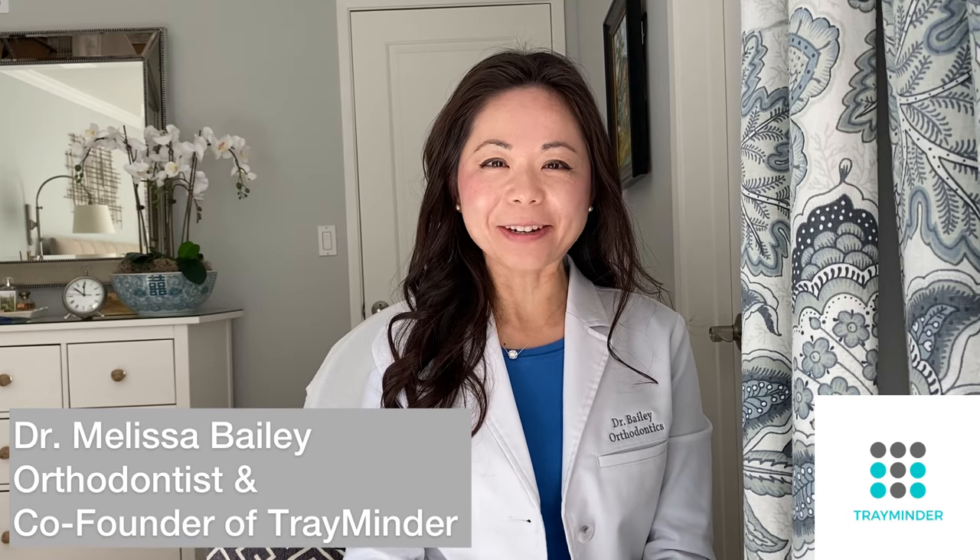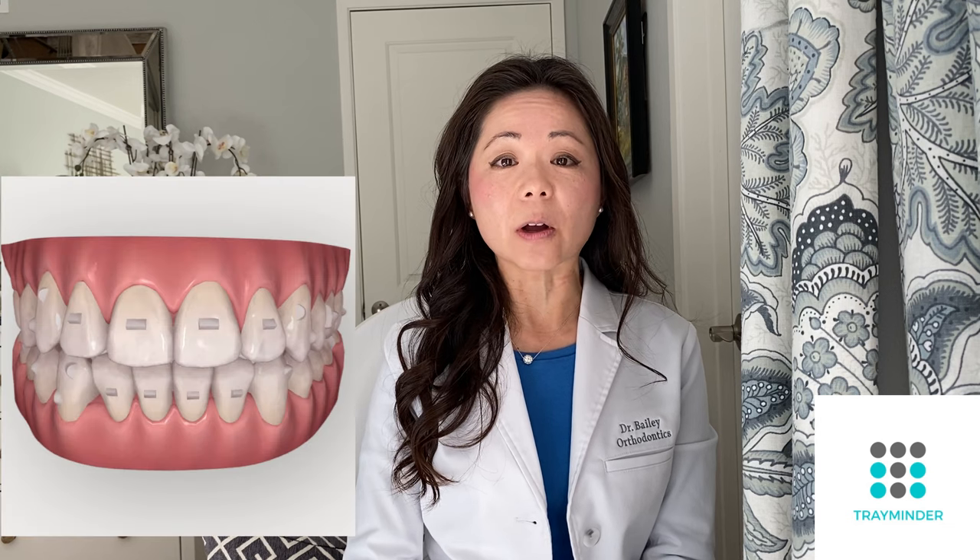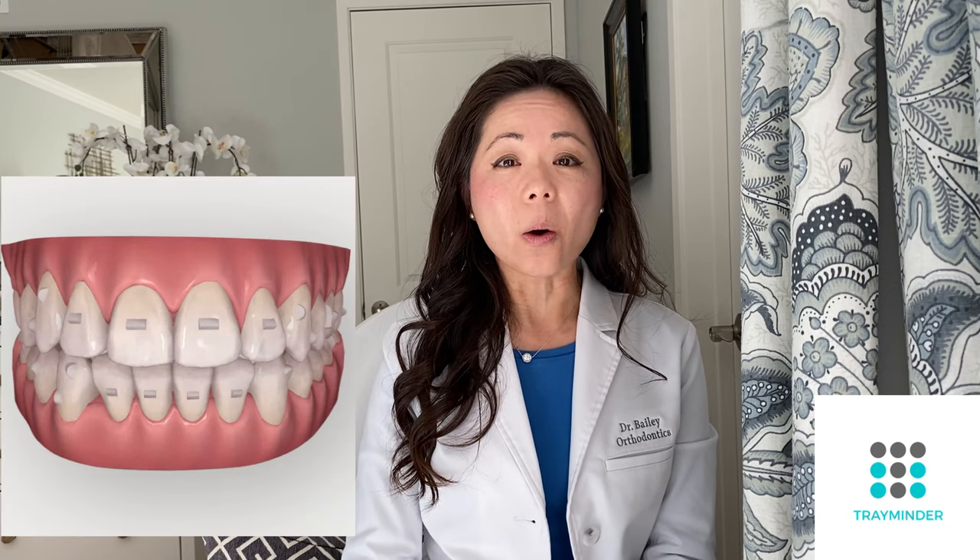Hi guys, this is Dr. Bailey from TrayMinder. Today I'm going to do a follow-up video on a very popular video I put out about two years ago on how to properly remove your clear aligners. A lot of you have told me it's been helpful, but that sometimes it's still quite difficult, especially at the beginning when you're first getting started. Sometimes that can be nerve-wracking, especially if you have a lot of attachments on your teeth or if you start off with a lot of crowding.